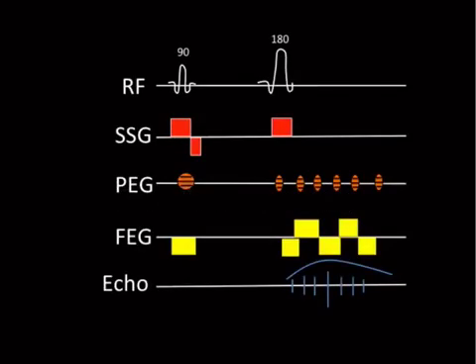All right. Lastly, we've got echoplanar imaging, which is a sort of a combination. Well, you can do it. So echoplanar can be done with spin echoes, 90 plus 180, or with gradient echoes, 90 plus a bunch of gradients. Echoplanars are very fast.